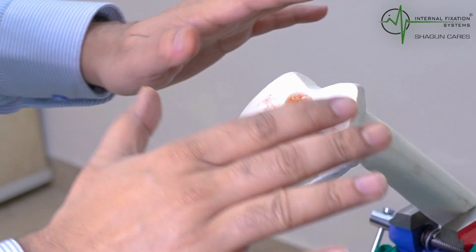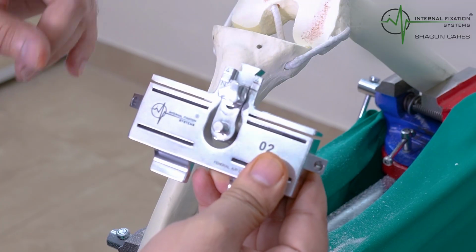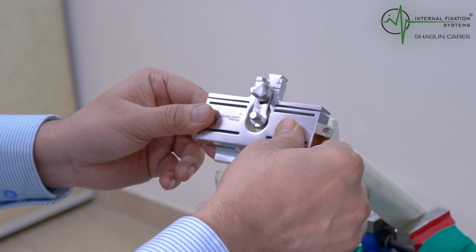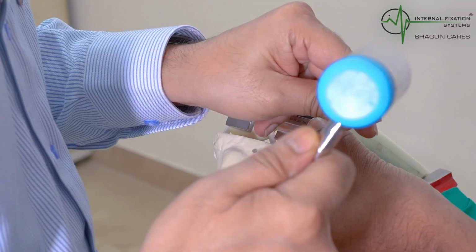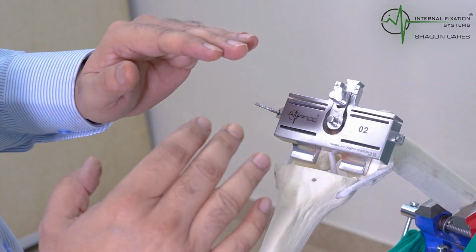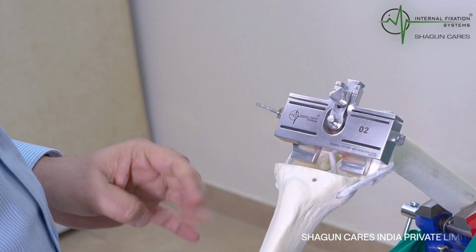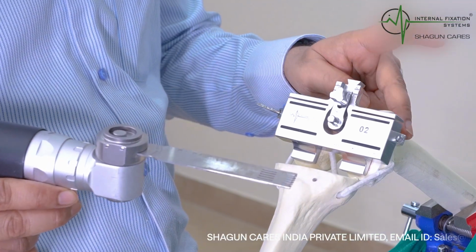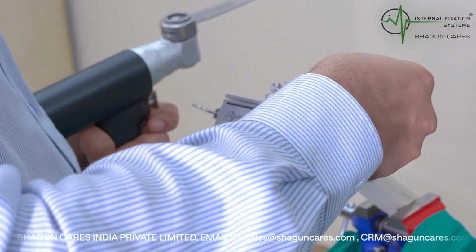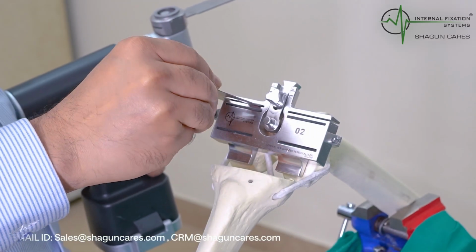You can see that slowly we are preparing this canal for accommodating our implant. Now we are going to use this jig to go inside. This is specific. You can see the 02 size, and we put it inside. Now we are going to take different cuts in the upper direction, lower direction, and the chamfer cuts. You can see this is the upper edge. You need to see that we avoid a piano sign. We need to be careful about the notching here. This is a very crucial step, that we do not cut it too low.